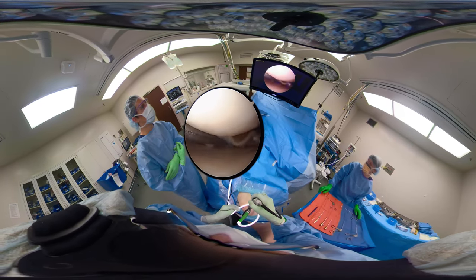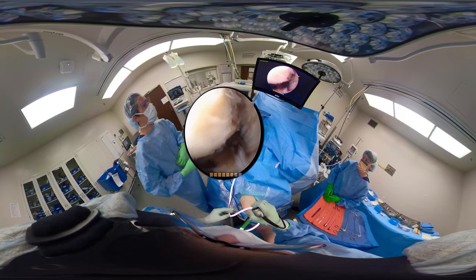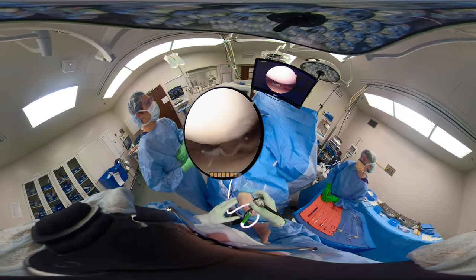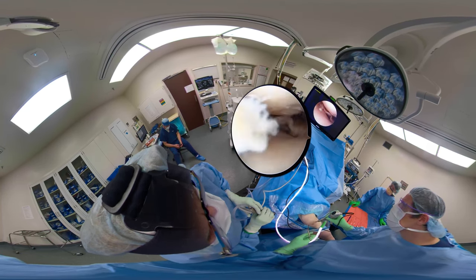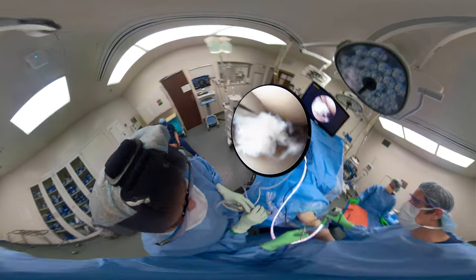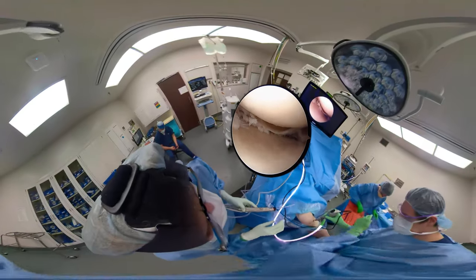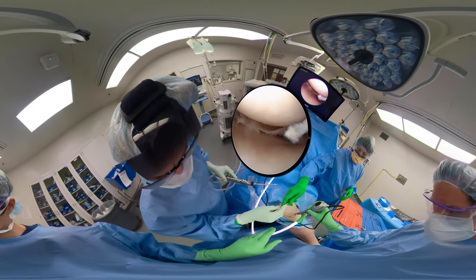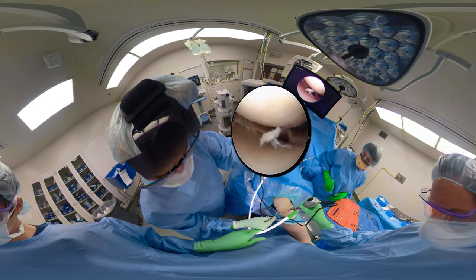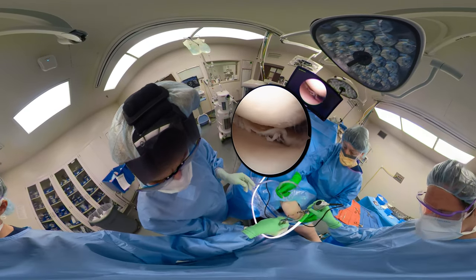You can see where there's a tibial-sided unstable horizontal split in the meniscus. Looking at the posterior horn, that looks to be intact. You can take a handheld punch or motorized resector and complete the partial medial meniscectomy. If you have a lot of fragments, as in this case, put a big cannula in and suction directly on the cannula. The curved shaver will tend to clog if you try to do all this with a shaver — you want to be as efficient as you can.